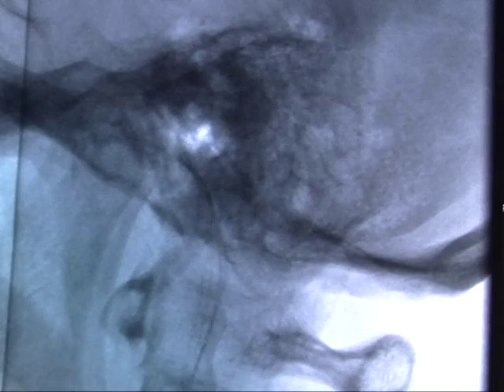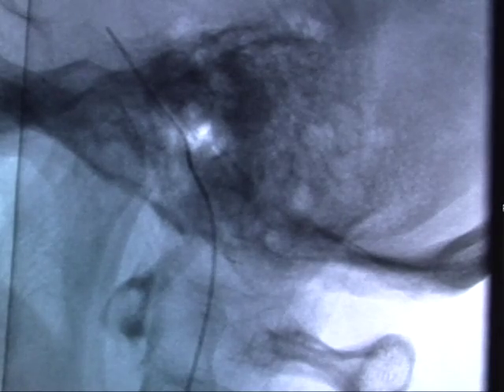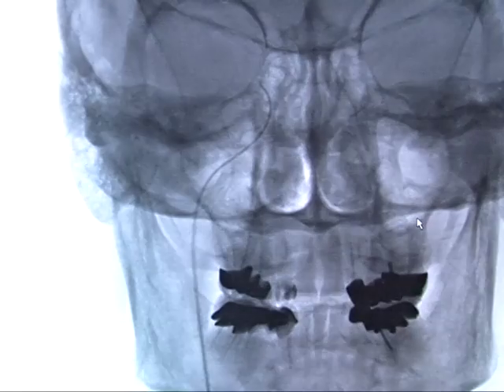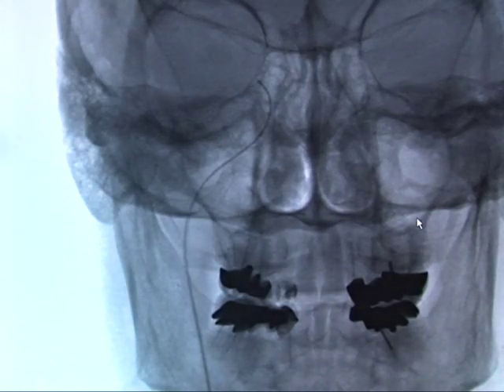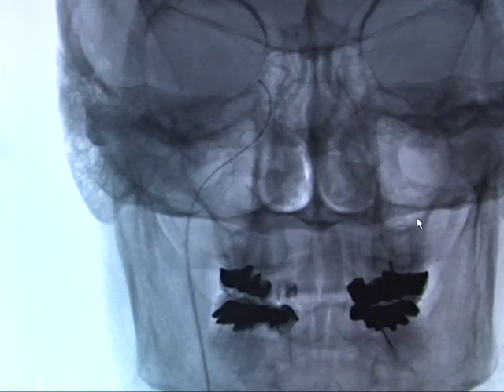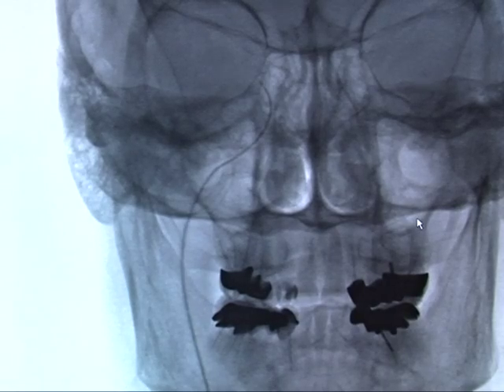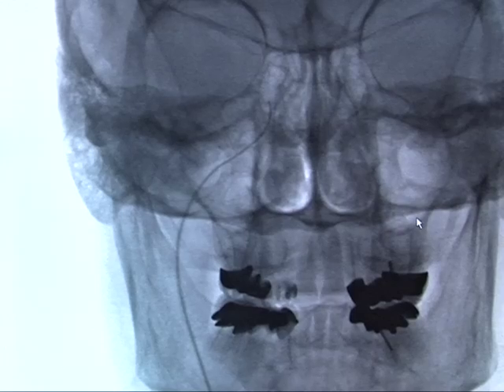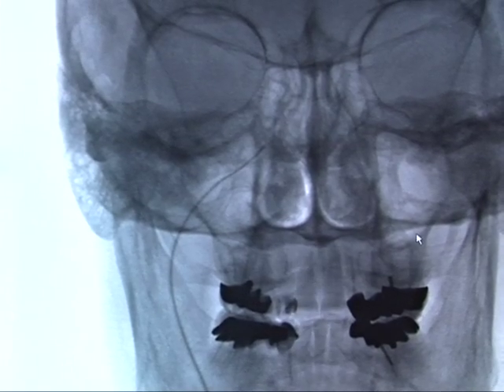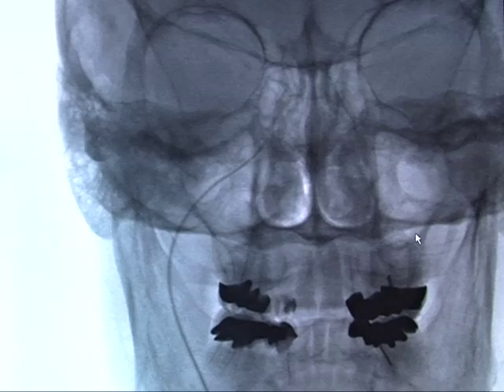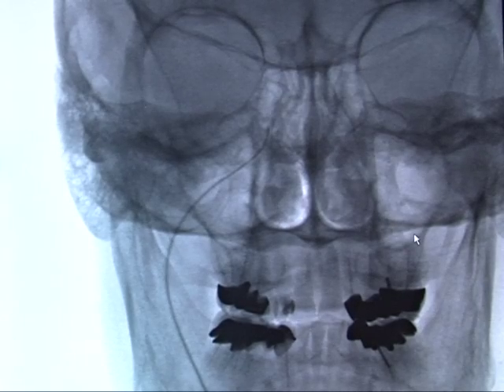An important landmark is the clivus. The wire advances along the clivus. Here the wire is medial and, as seen in the previous lateral view, it was aimed anteriorly. A five French straight catheter is now advanced over the wire into the right inferior petrosal sinus.